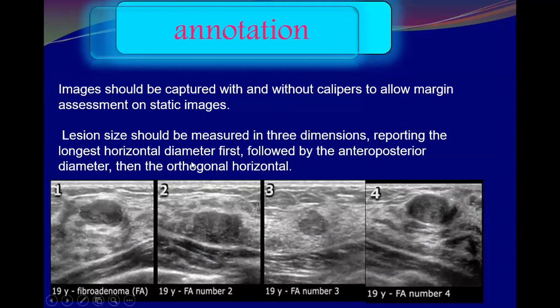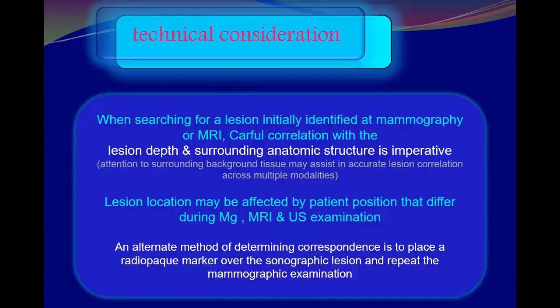And we have to document an image with measurement and without measurements for the lesion. Not to take all the images just with the measurement and that is it. For the same lesion, you have to have an image with measurement and an image without calipers, without measurements.